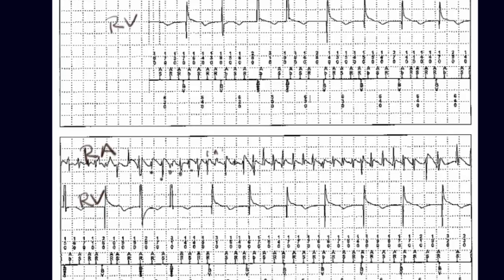In this case, something that is not easy to see — you see these two letters here that correspond to this signal, same thing with this one over here and this one over here. It says there's a B and a V. Anyone have any idea what that means?